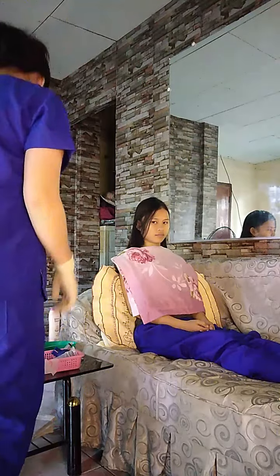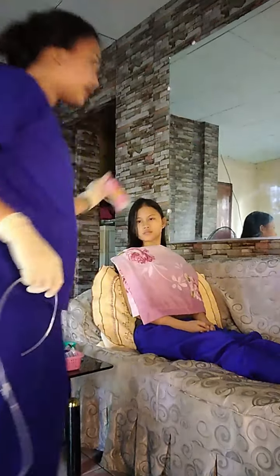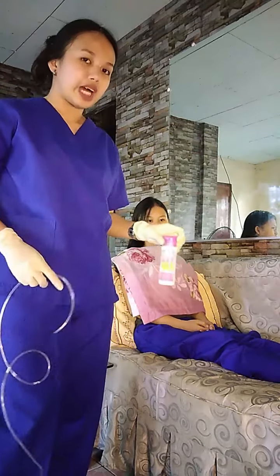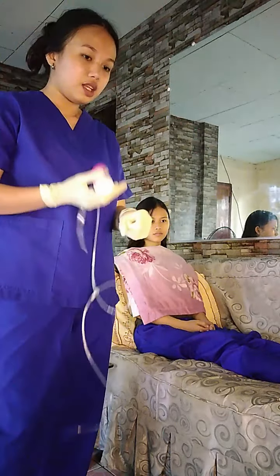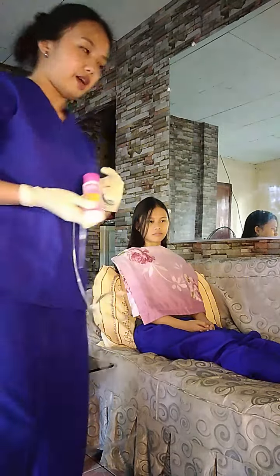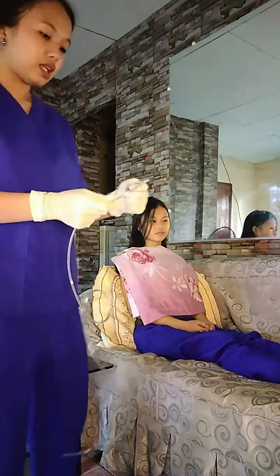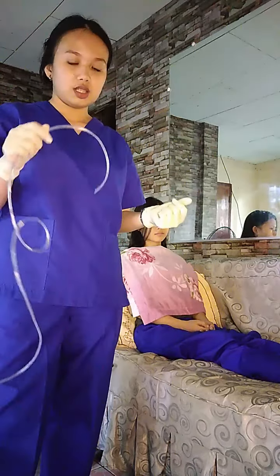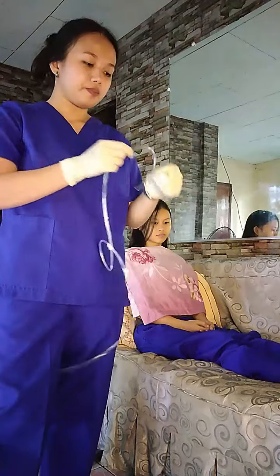So, pagkatapos nun, I'll get the tube. And then, I will also get the water-soluble lubricant. And put a little in my glove. So, assuming that I have already put water-soluble lubricant, I will lubricate the tip of the tube 4 to 8 inches, starting from the tip. Ayan.